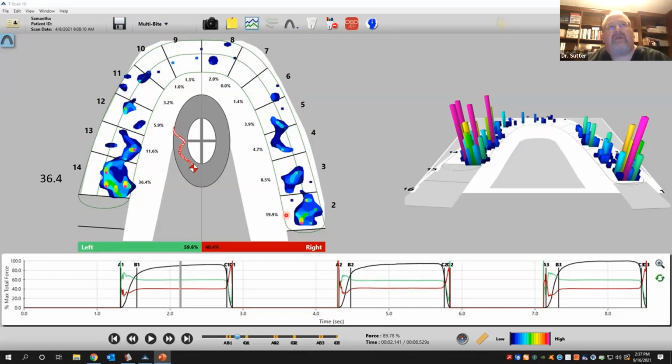Or you could kill the nerve, and all of a sudden you need a root canal, buildup and crown. Or you can have bone loss. So all of these things, just have them at the tip of your tongue where you can say, hey, these are a couple of things that I'm concerned about with teeth being overloaded, and I just need to make you aware. Well, she didn't hesitate to treat it and just get the bite revised and optimized.